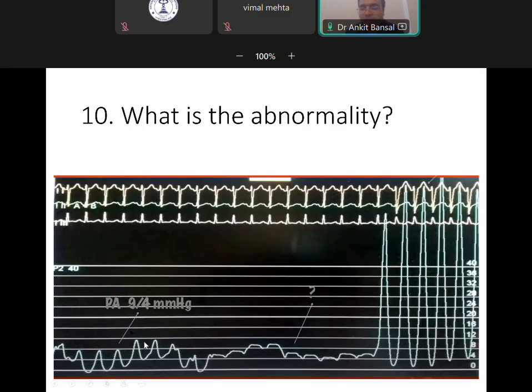When we are pulling the catheter, once the catheter is coming into the obstructed part where the obstruction is, the pressures are going further down because of the Venturi phenomenon. And when the catheter is out into the RV, we can see the increased RV pressure.